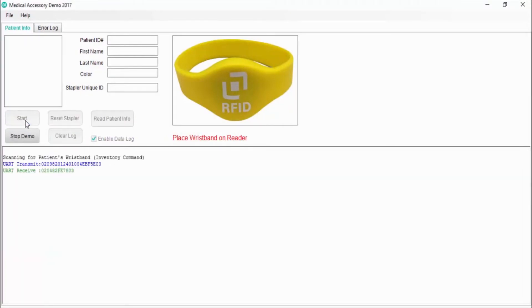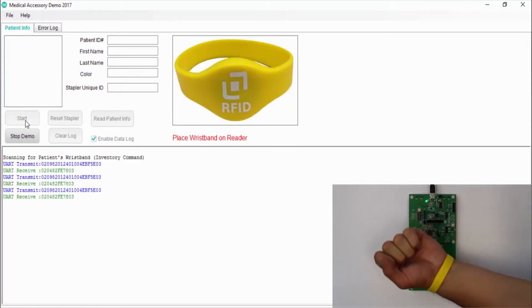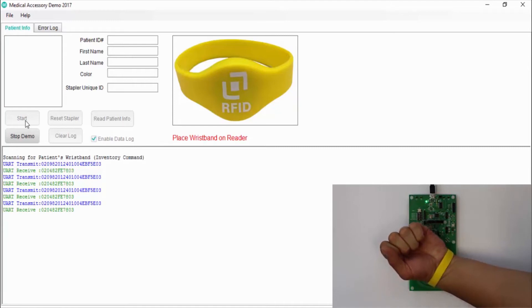The software application is ready and to begin we press the start button. The software prompts to place the patient wristband on the NFC reader. The reader runs authentication on the patient's wristband and reads the patient information.